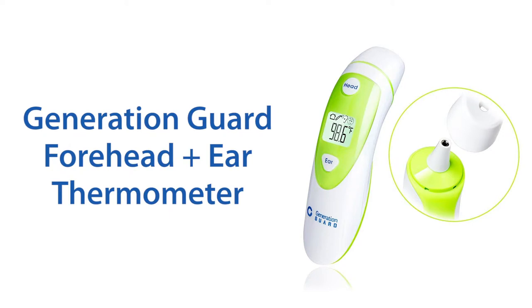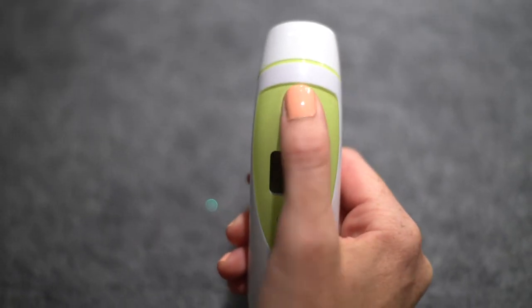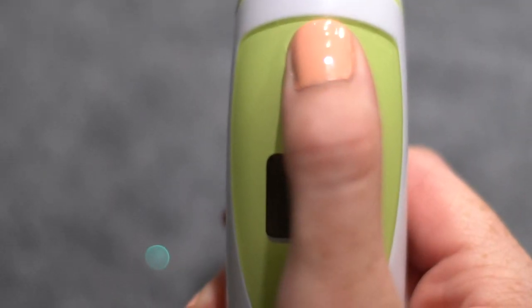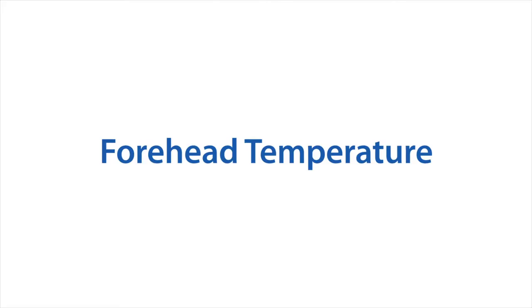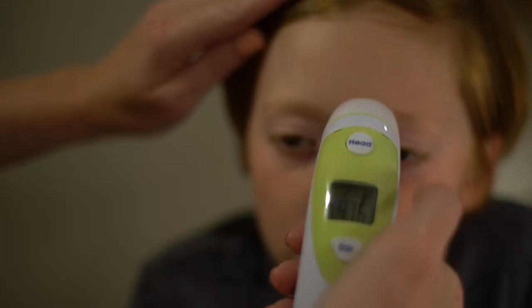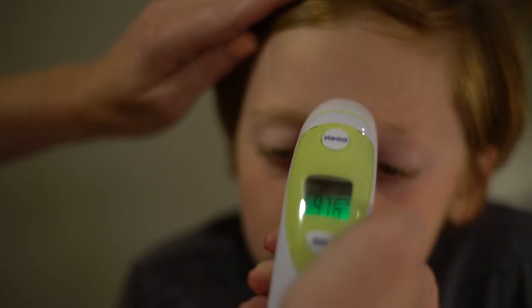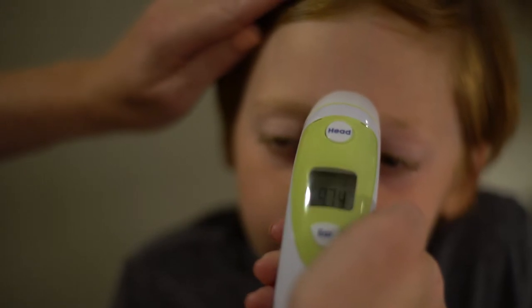This is a forehead and ear thermometer. When taking temperatures, press the button once and quickly — do not hold the buttons for a long time, as the sensor is sensitive to heat. When taking a forehead temperature, position the probe just above the middle of the eyebrows, keep contact, and press the head button to take a reading.